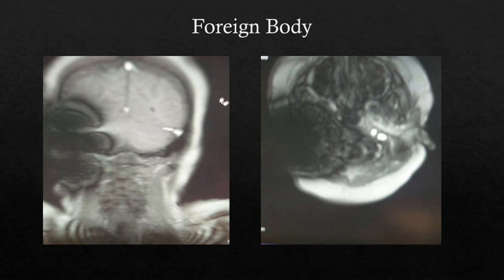So brought this patient off. It does look like it's in the right ear IAM area, so had a chat to the family. Definitely no surgery. They don't know if the patient had any piercings or anything like that. He's very young. So we asked our ENT colleagues, so the patient was under GA, so we didn't want to wake them up at this stage.